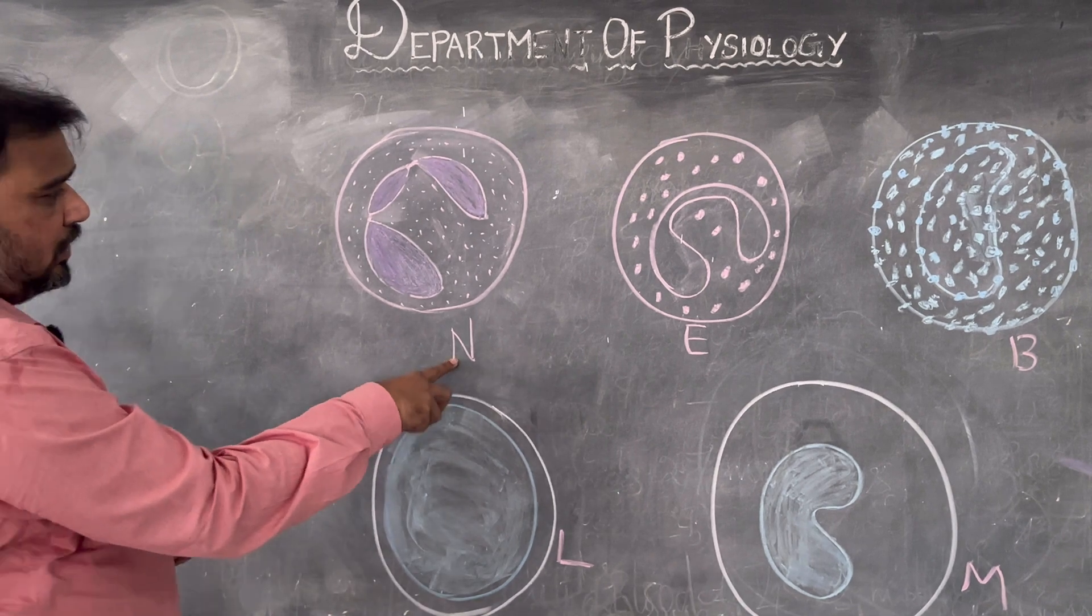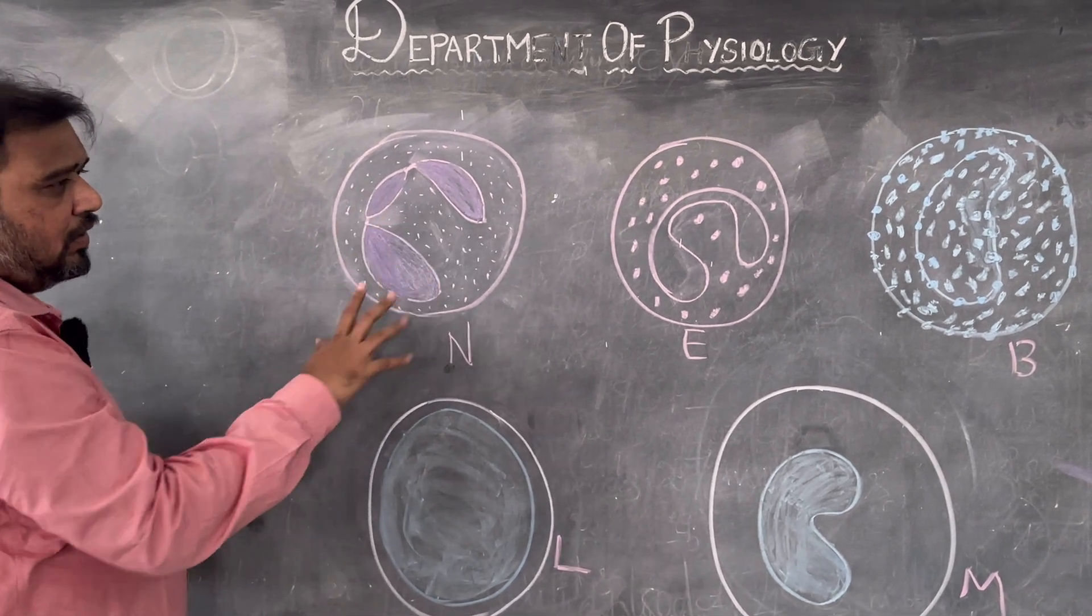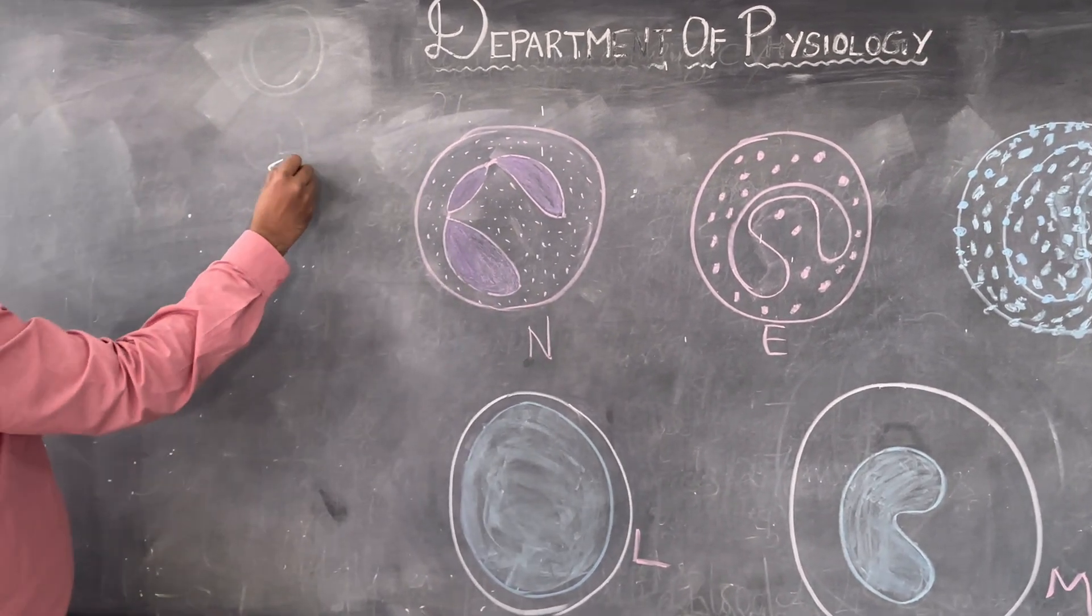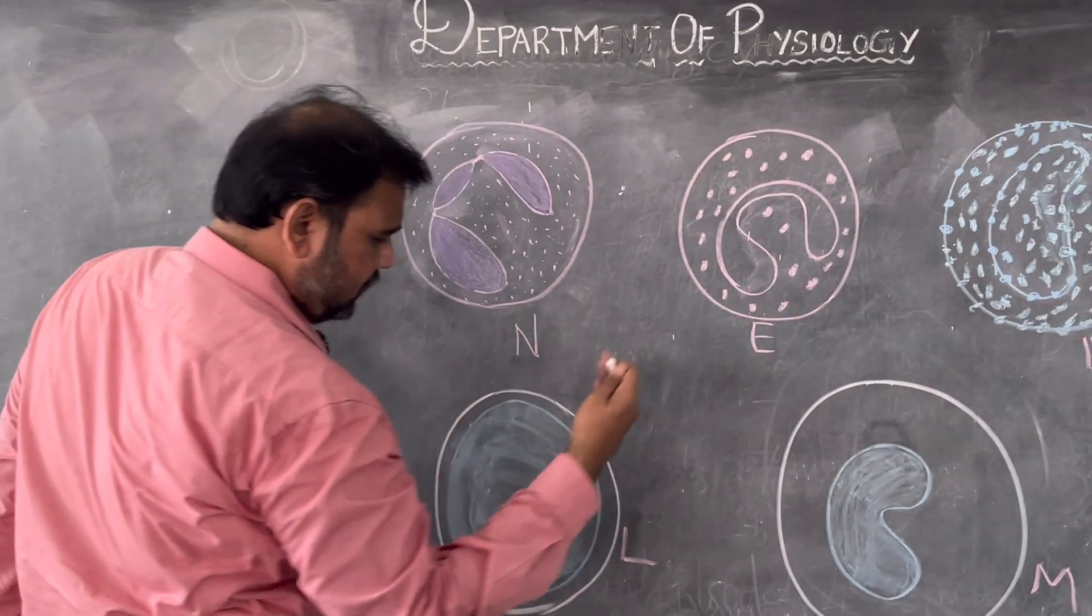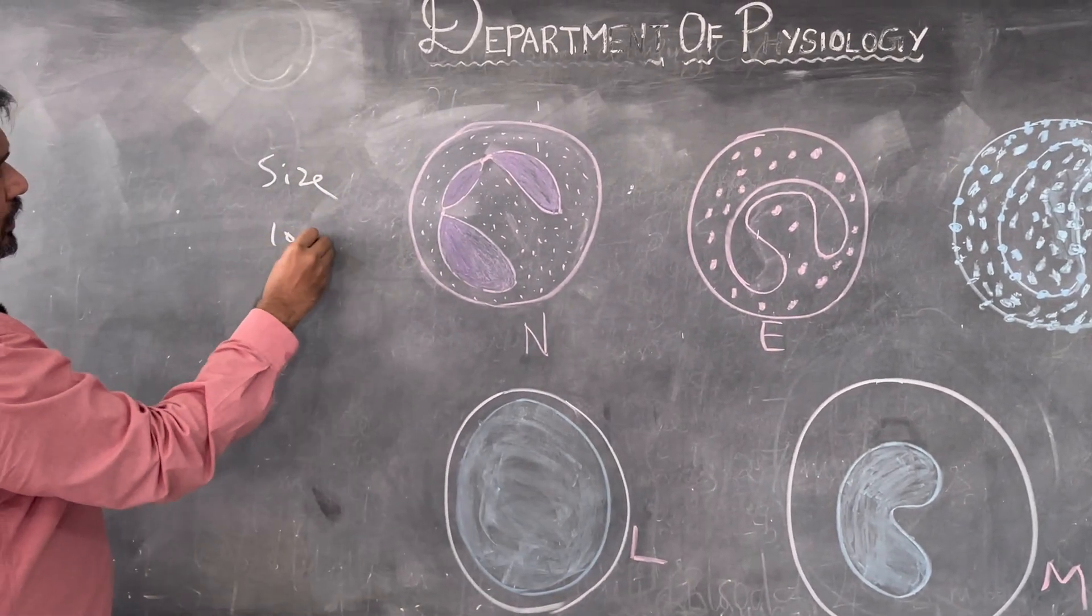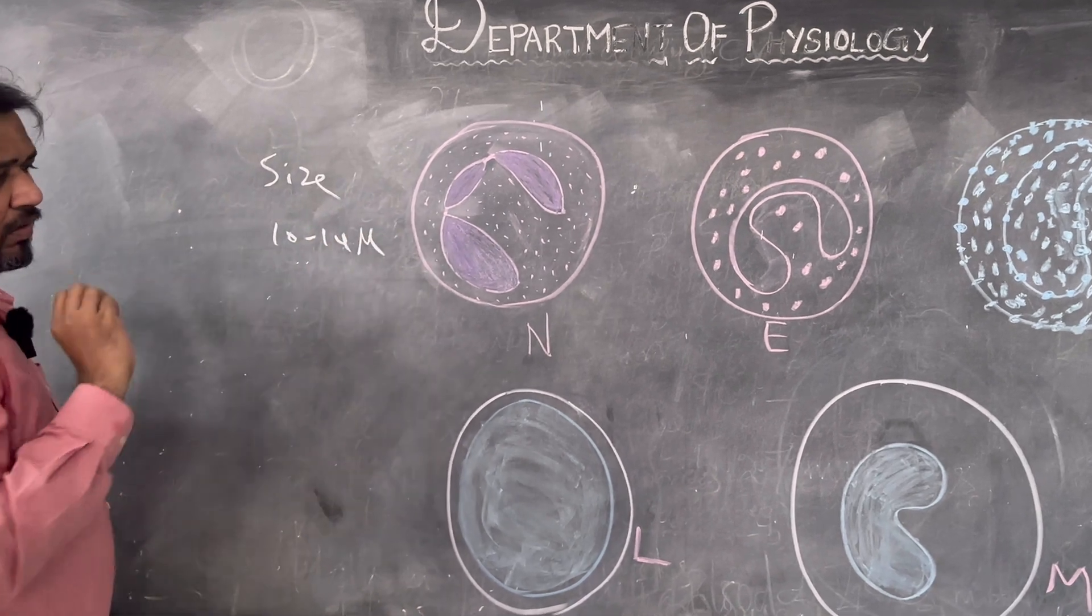Just concentrate. This is neutrophil, and you can see here three lobed neutrophil. Regarding size, neutrophil, eosinophil, basophil, and lymphocyte all are around 10 to 14 microns in diameter.